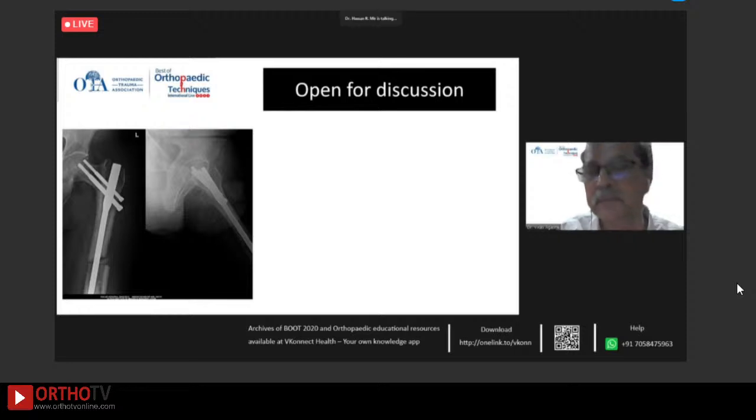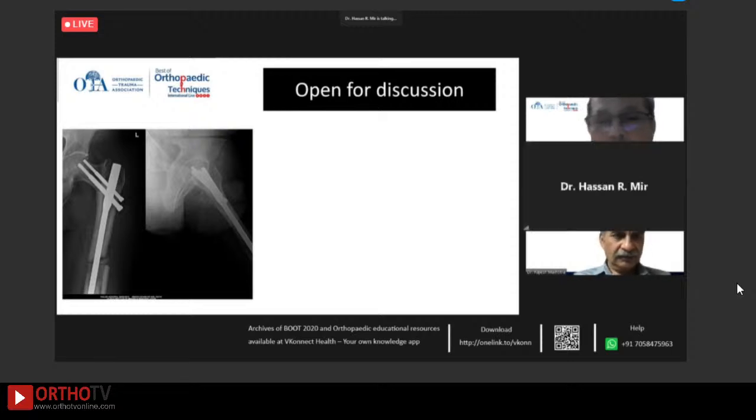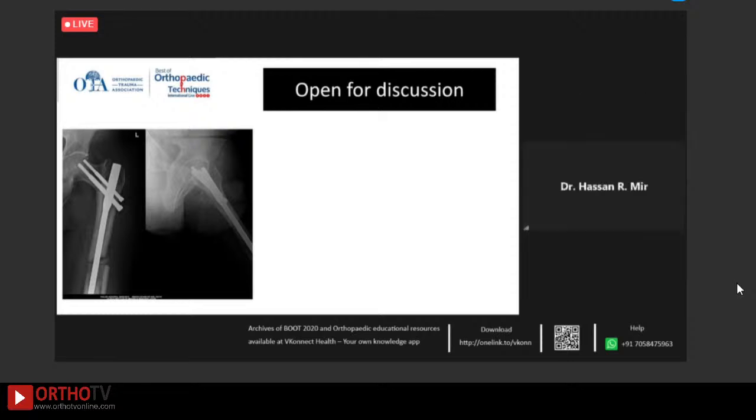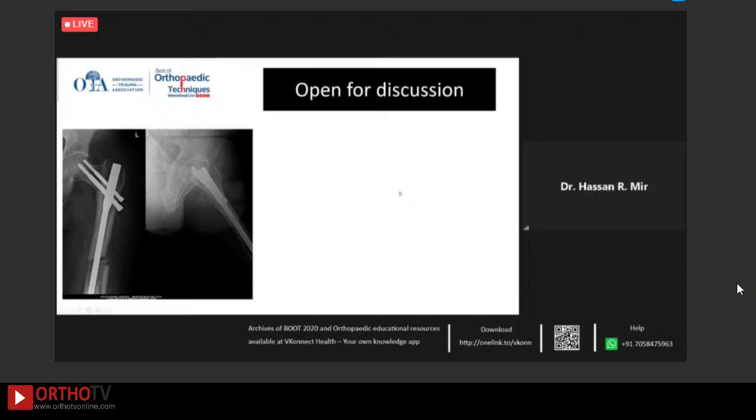I would do a cephalomedullary nail, and I would harvest bone graft at the same time and utilize bone graft. And certainly at the shaft fracture, the consideration could be to revise it also with a retrograde nail and then a dynamic hip screw and anti-rotation screw and treat them as two separate injuries, which possibly could have been done on the index procedure. But I think one of those two constructs would be my choice.